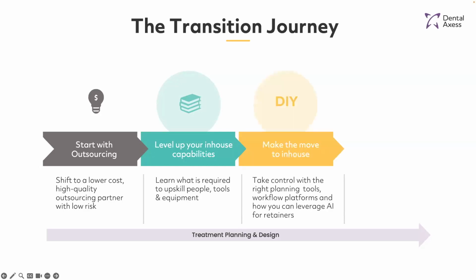And as you progress, it's essential to take control and consider implementing advanced treatment planning software tailored to your practice's needs. So establishing efficient workflows for streamlined case management, leveraging AI solutions for designing clear aligners or retainers.